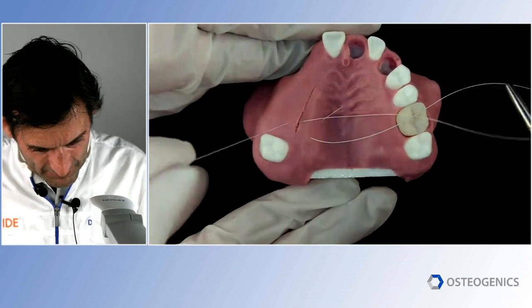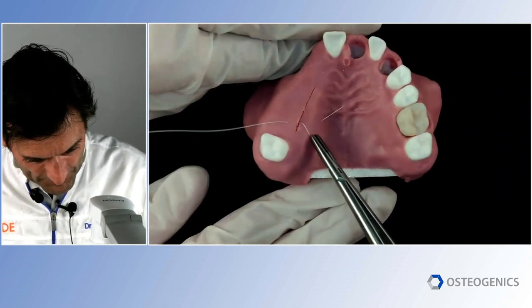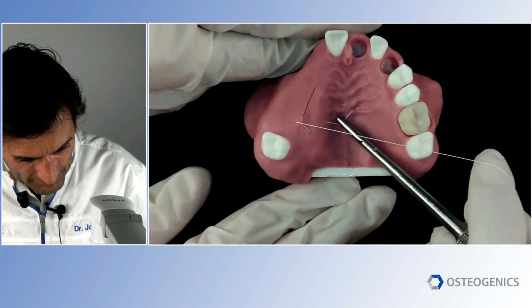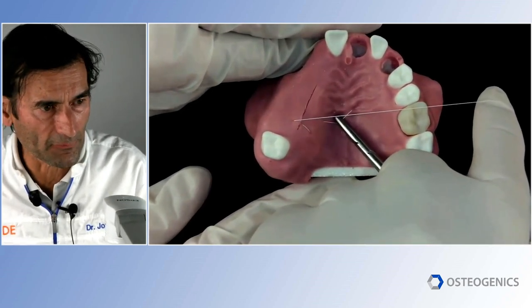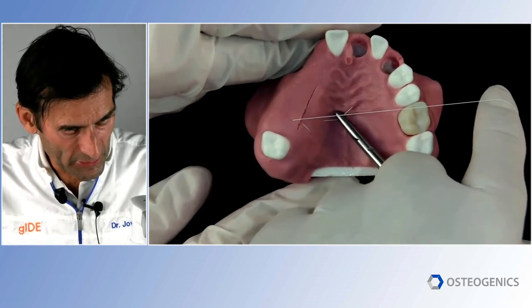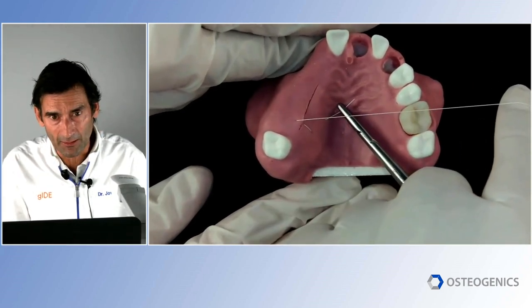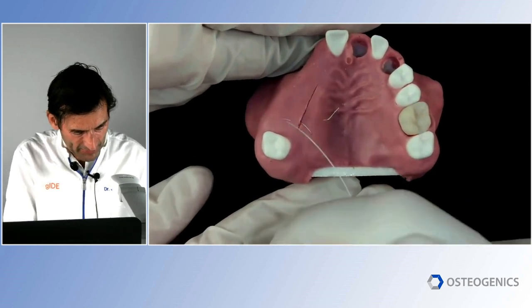Now what you will see is that in this particular area, from here to here, it's going to press the flap margin down. You can see it happening already. That compresses the outer flap to the inner periosteum. When you have a bleeder from the posterior, of course, that's very challenging, and it causes anxiety, but this can stop it right there. And then I tie the knot, right? Now I just have to tie it.